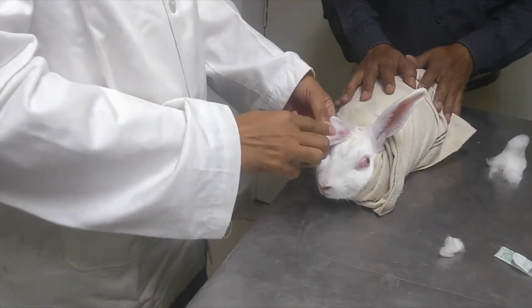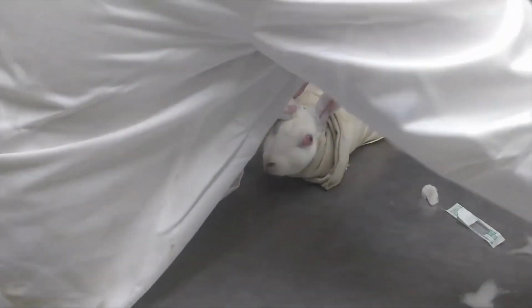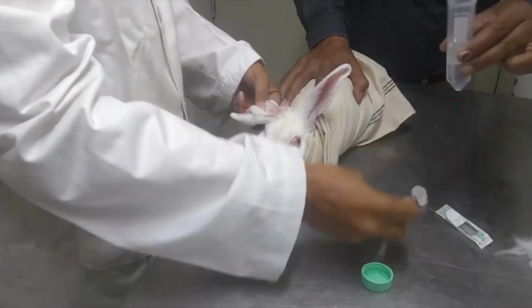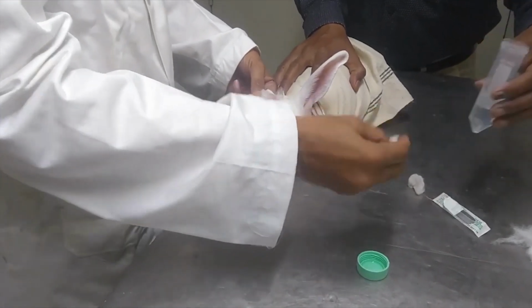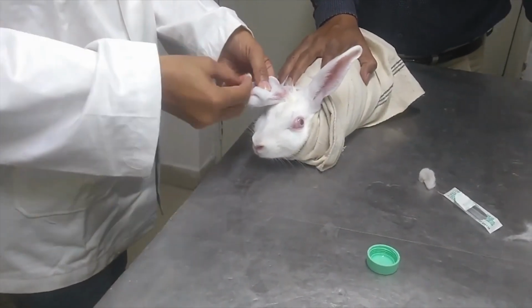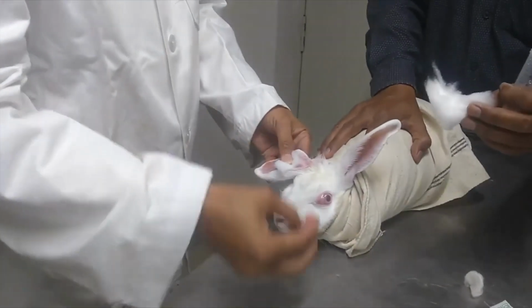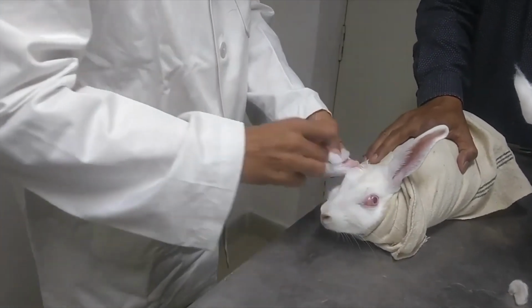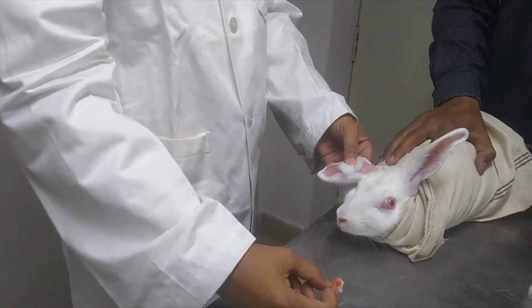Now we have to make sure that no further bleeding occurs. Then we wipe out whatever bleed is outside. Using sterile water, we wipe out all the blood here and there. If any spillage, we'll wipe out all over using water so that the vein becomes cool and gets shrunk.